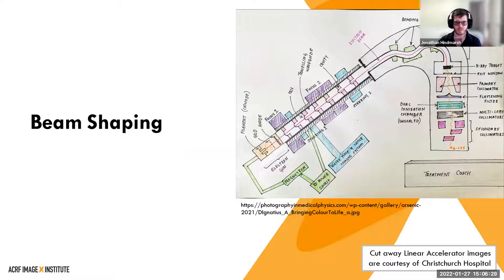Okay, beam shaping. So that was a very quick introduction. Now I'm going to be talking about beam shaping. Last week, Brendan gave us a really good introduction into how the electrons are accelerated, so from this part to this part. Today, I'm going to be talking about this section.